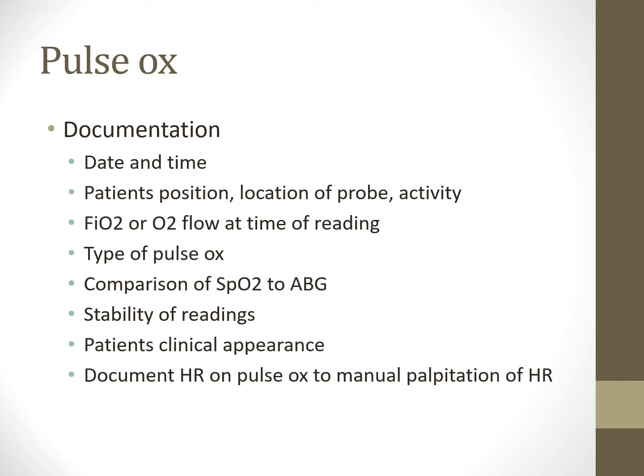Document the heart rate on the pulse ox against manual palpation. So that's like what I said with one of my finger pulse oxes, I would never document the first heart rate I've seen, because the algorithm in there has to have time before it gets that accuracy. So give it some time. But if the heart rate looks odd, then you're just going to want to palpate or auscultate the heart rate. I worked a lot in pediatrics as well as the adults. On the pediatric side of things, you usually auscultate the heart rate with those little guys, especially neonates.